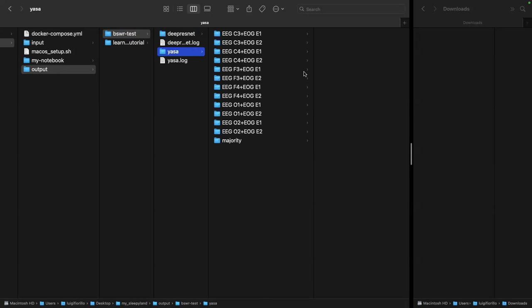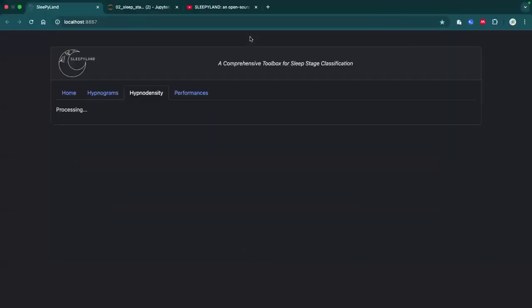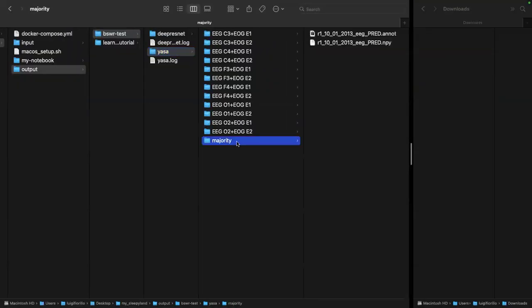Right. So basically, you can use it also running your own EDF. Of course, you have to wait, as always, a little bit. In that case, you see, the processing may be heavier because you are actually predicting on different combinations. And as I showed you here, in that case, for example, you have really a lot of combinations to then expose the majority voting on the prediction.